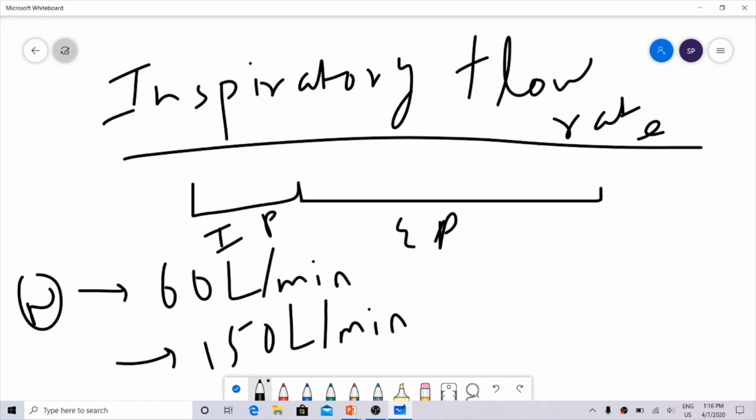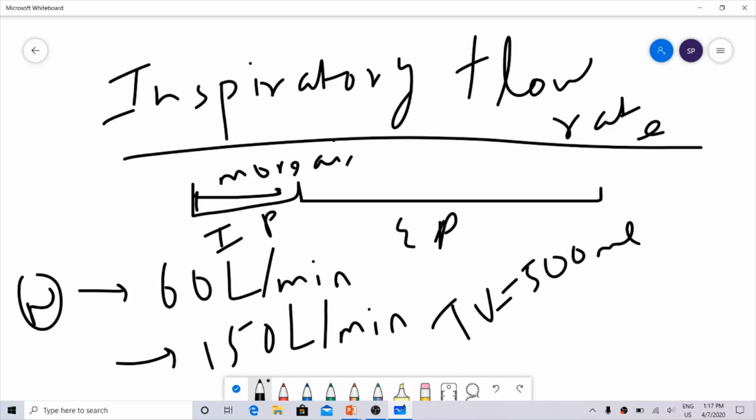So there's one feature in a ventilator. You can actually increase something known as the inspiratory flow rate. Inspiratory flow rate is how much air flows when you inhale. Normally, 60 liters of air per minute is a normal inspiratory flow rate in a normal patient. Instead of giving 60 liters per minute, you give 150 liters per minute. You provide more air, more pressureful air, because you still give the same tidal volume of 500 ml, but with a higher flow rate.